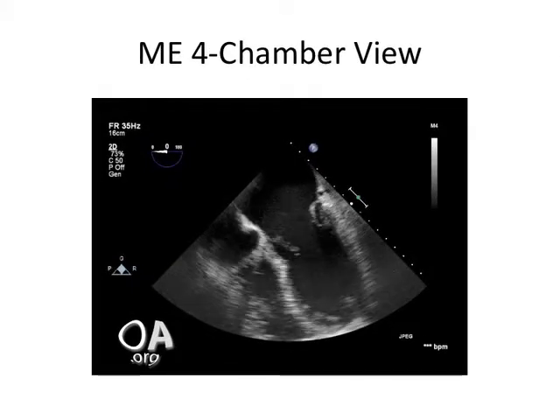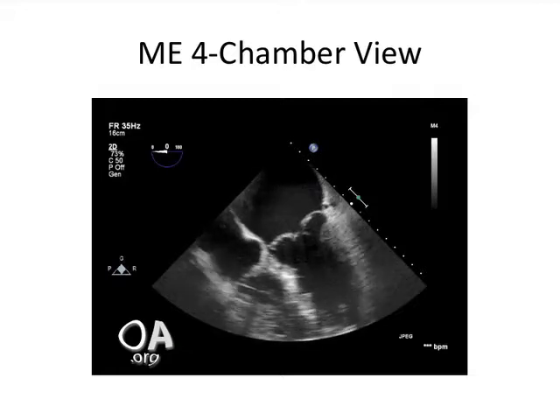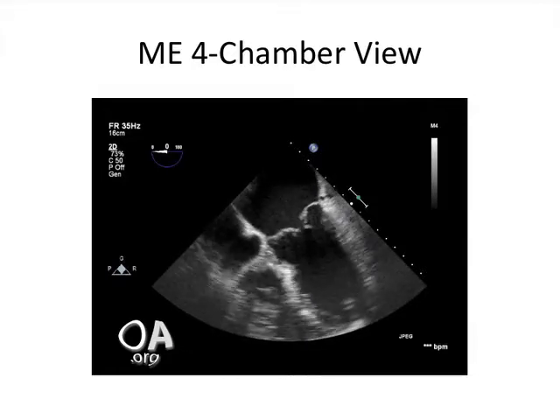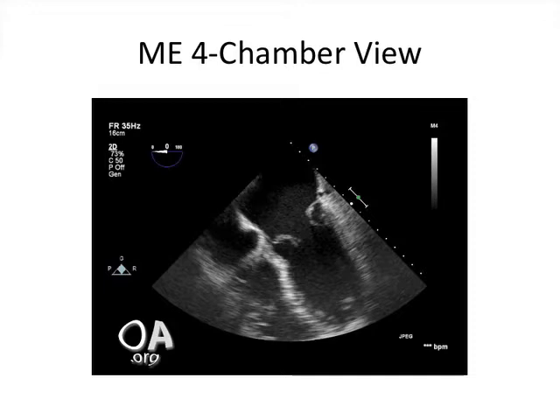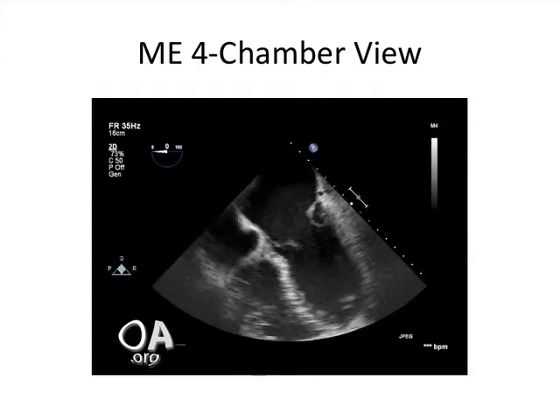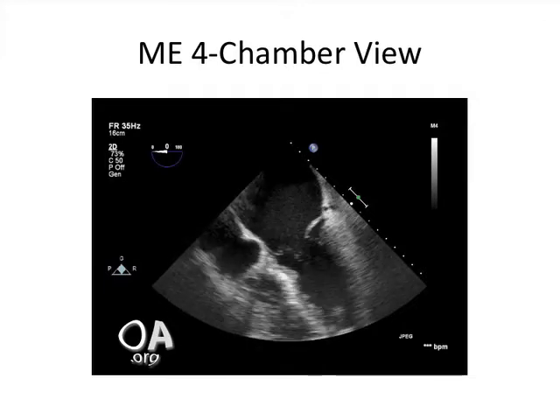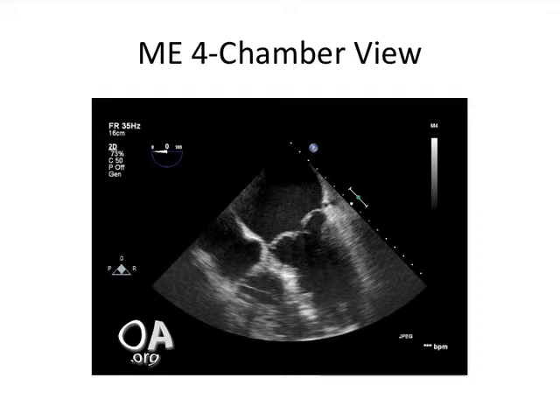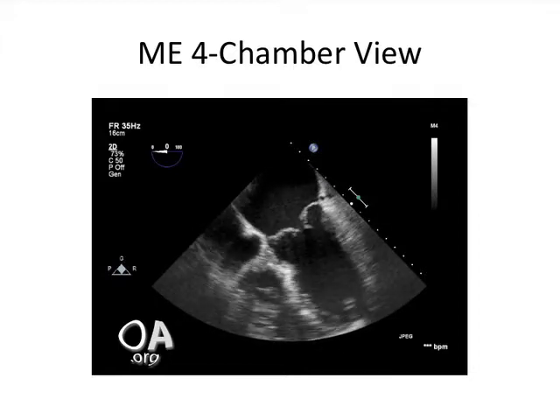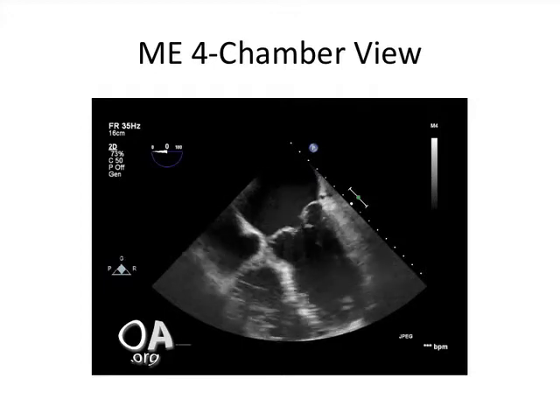There are multiple echocardiographic methods with which to assess the severity of mitral regurgitation. These TEE images will not focus on those methods specifically, but instead on a few short TEE clips demonstrating mitral regurgitation. Please note that each clip is a single cardiac cycle that is looped repeatedly. This may create the appearance of an arrhythmia. The TEE video has also been slowed significantly for demonstration.